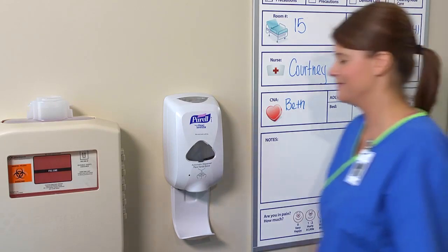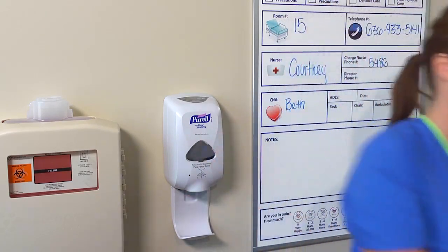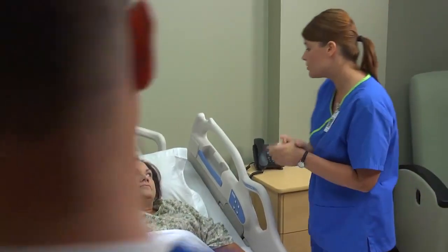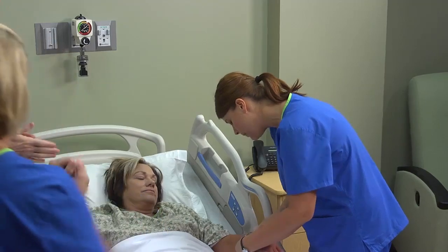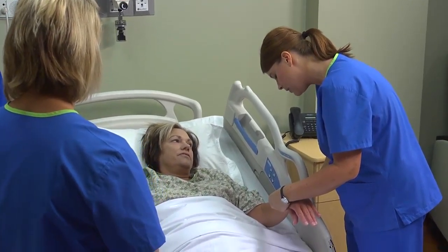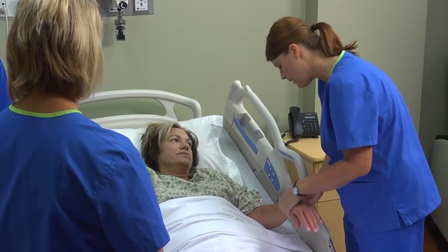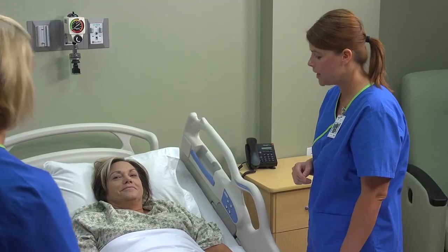After performing hand hygiene and ensuring privacy, introduce yourself to the patient. Then identify the patient using 2 identifiers. I'm going to check your name band here. Can you tell me your first and last name? Sue Reed. And your date of birth? 5/23/55. Okay. We've got Dieter and Teresa here to help us transfer you. We're going to get you ready now.